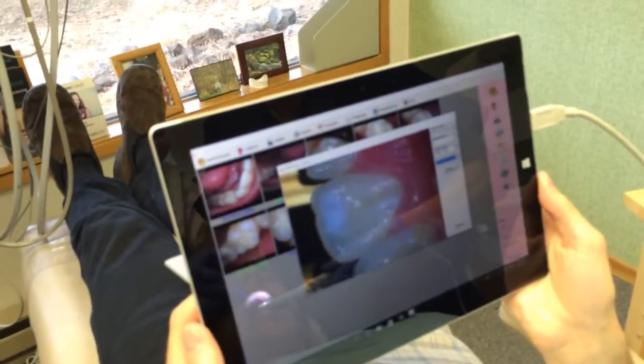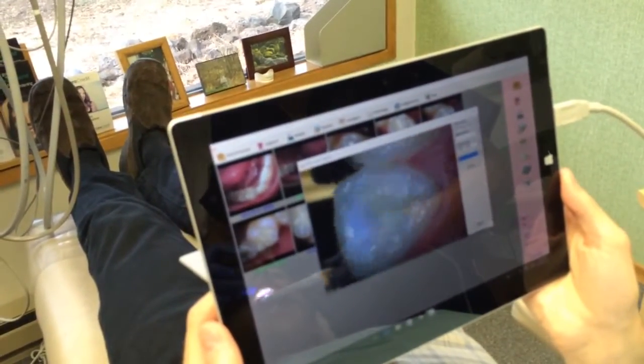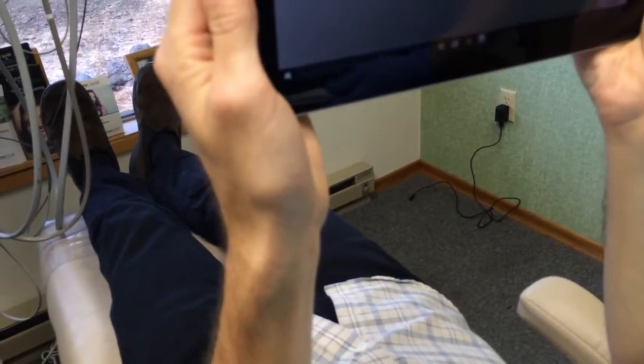Like this, you can see this. Oh yeah, better. That's beautiful, that's gorgeous. This is pretty cool. This is better than Dr. Quicklook that we were challenged with. So you could see the backside. And I could see mine too, I guess. And if they've got a whole bunch of calculus, you can show them the calculus.